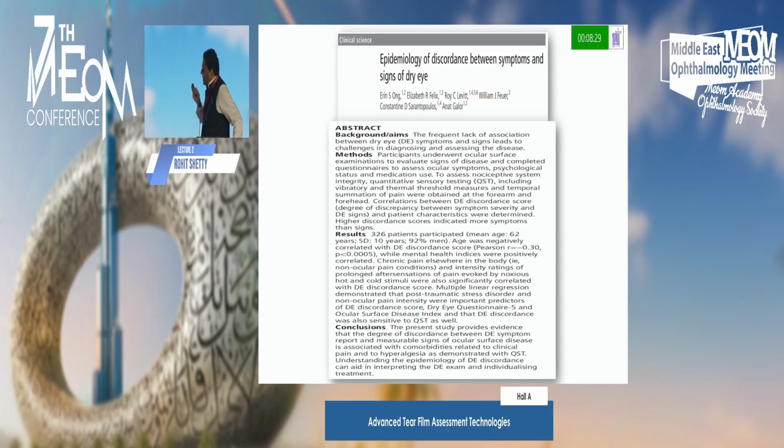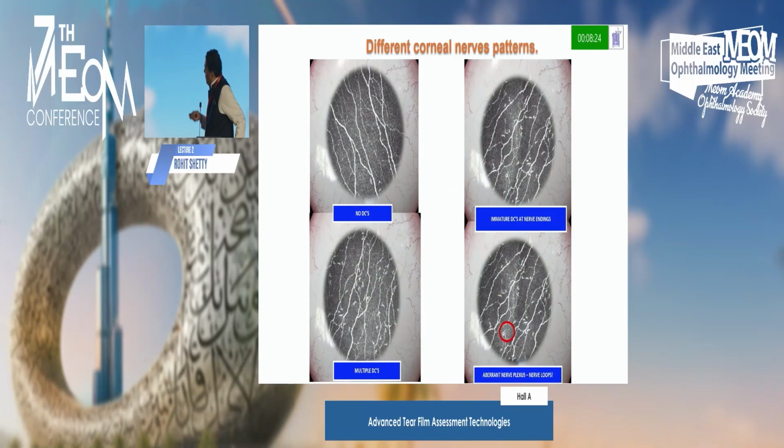Confocal microscopy talks about the pain without stain and many aspects of the disease. We started looking at confocal microscopy many years ago, and there are healthy nerves, and these are your dendritic cells. But recently, there's been a paper from New Zealand which says that these are not all dendritic cells. Some of them are T lymphocytes. It's very interesting because dendritic cells are the ones which have a lot of tentacles, but these ones do not. If you measure them over a day, you can actually see them moving. That means this T cell can become that or come here. It's very interesting to see them change.